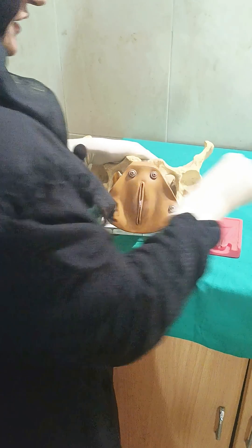Move out this piston, and after that, when there is enough space, I will do the to-and-fro motion so that the maximum tissue can get into this cannula.